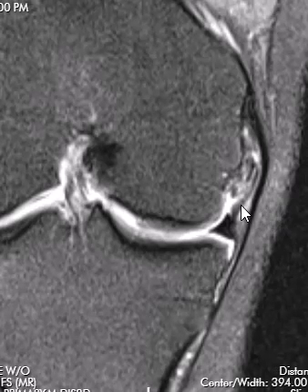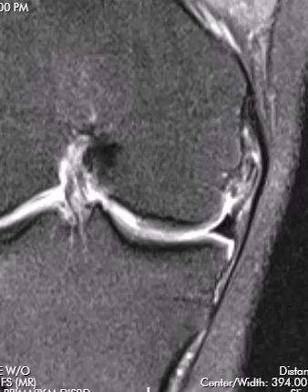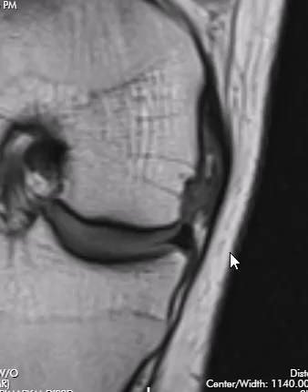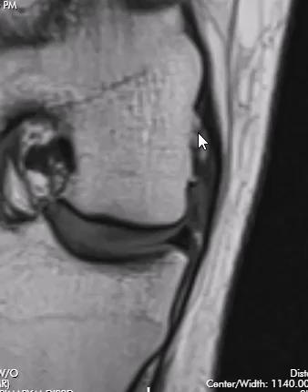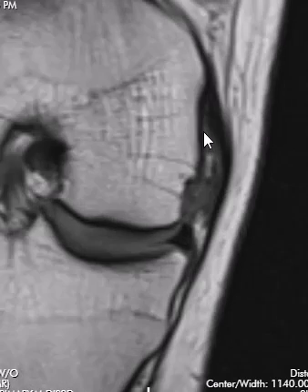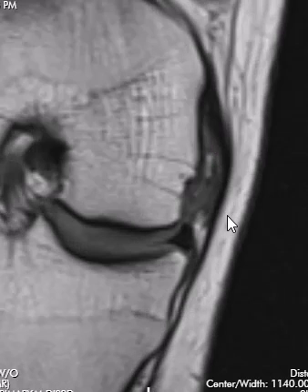This is actually calcification here. This is just a good example — if we can see there are two separate things, superficial and deep fibers, and on this one we have the tear that's retracted. On this coronal T1 image, we can see the periosteum has been injured, and there's that calcification on the T1 images.